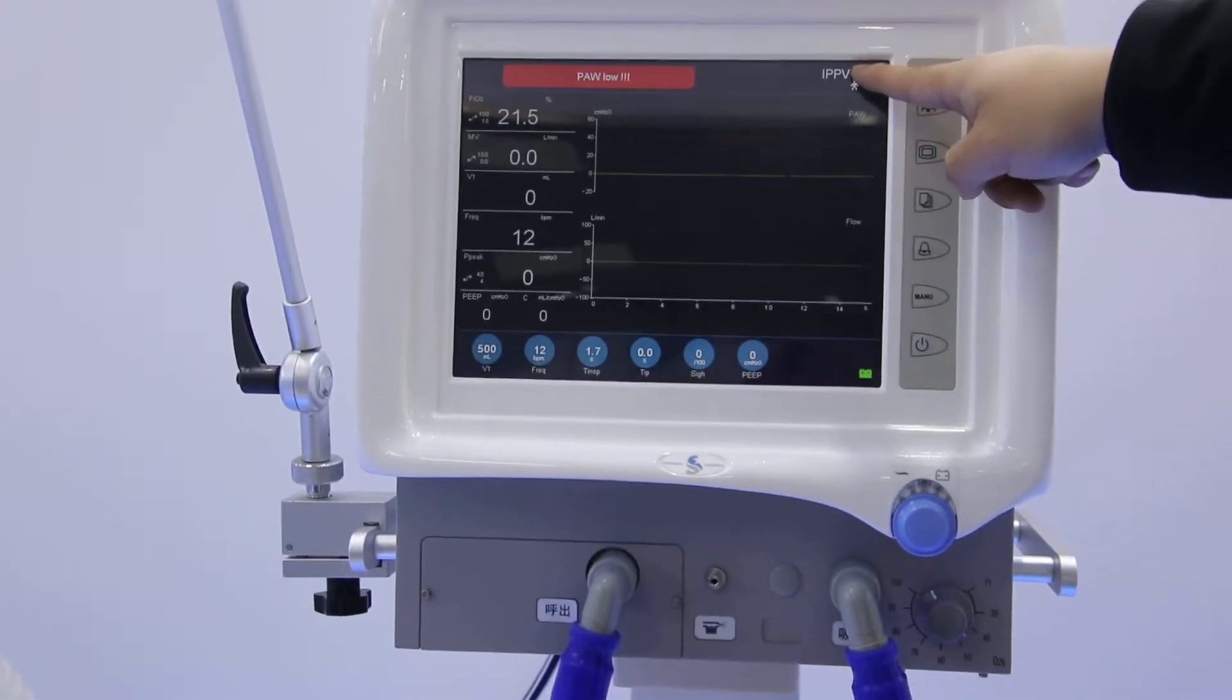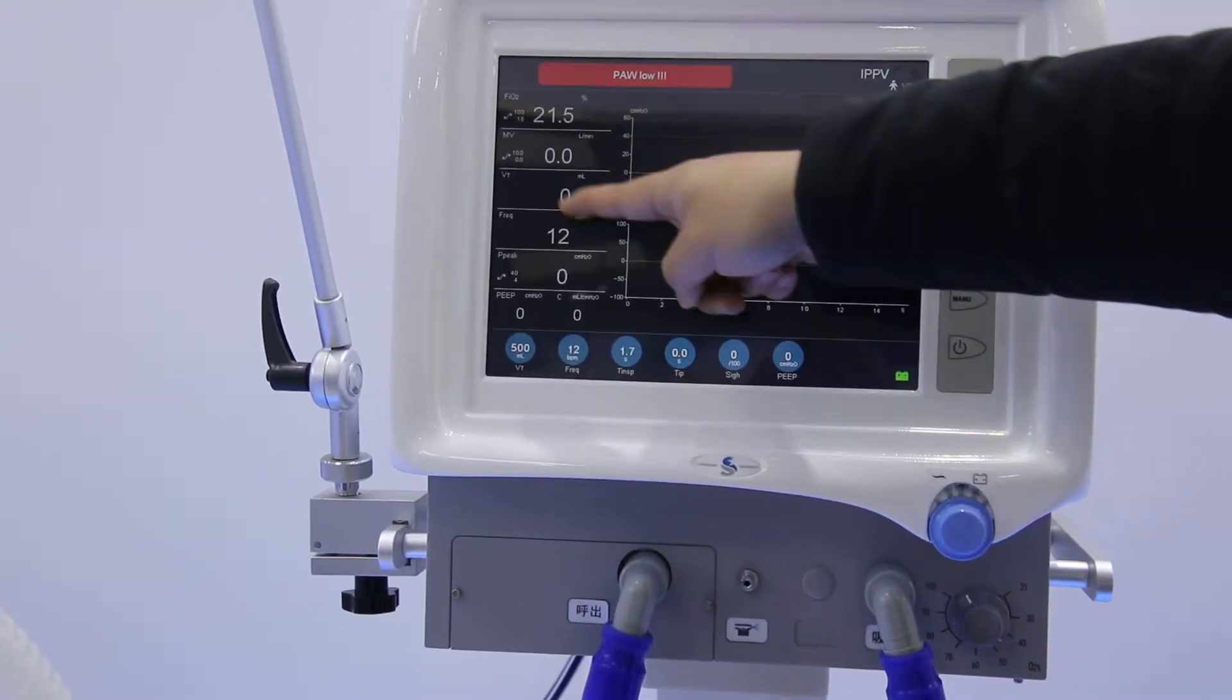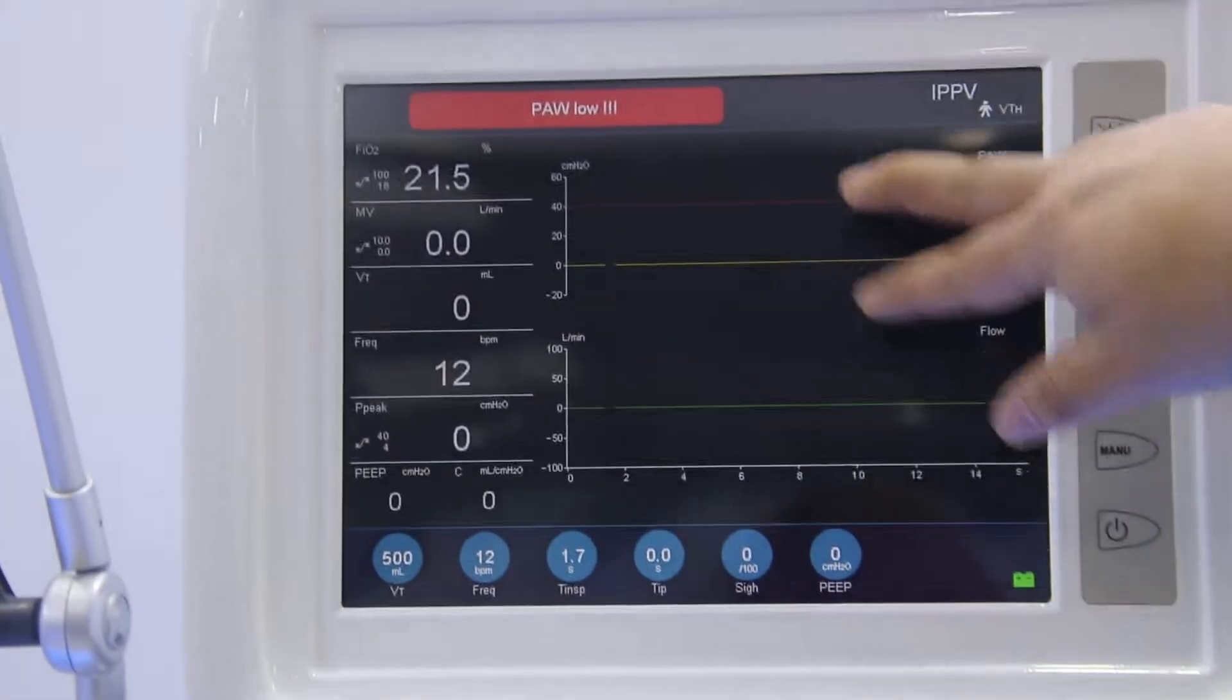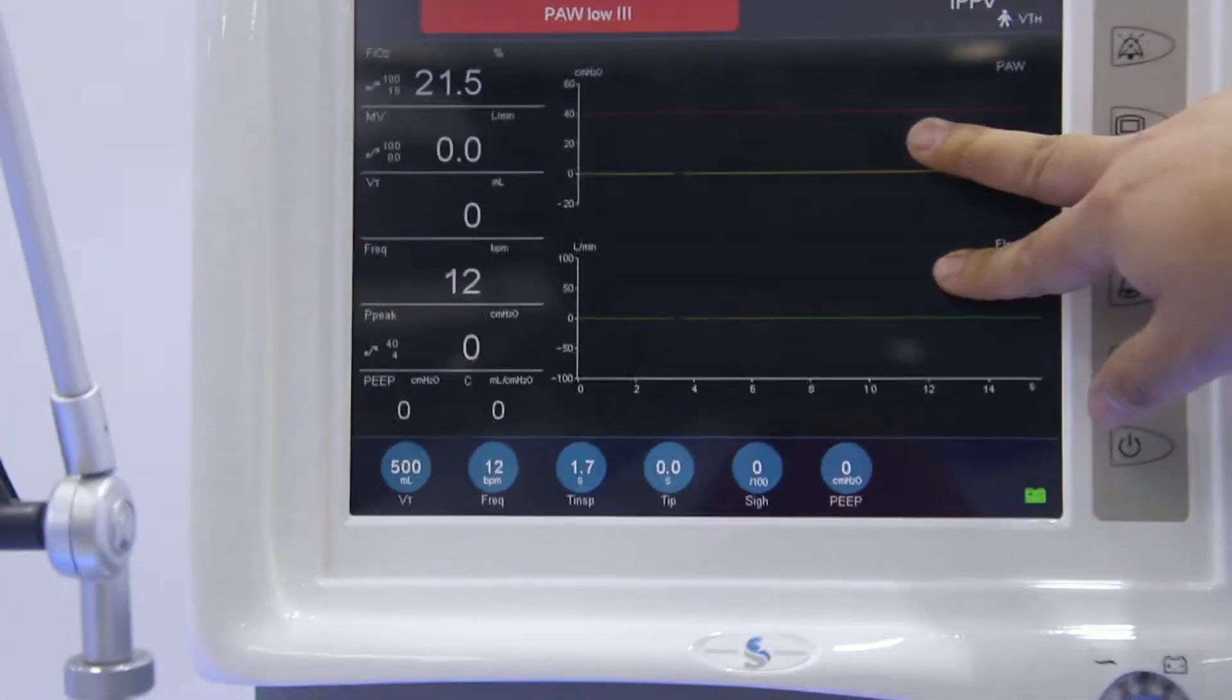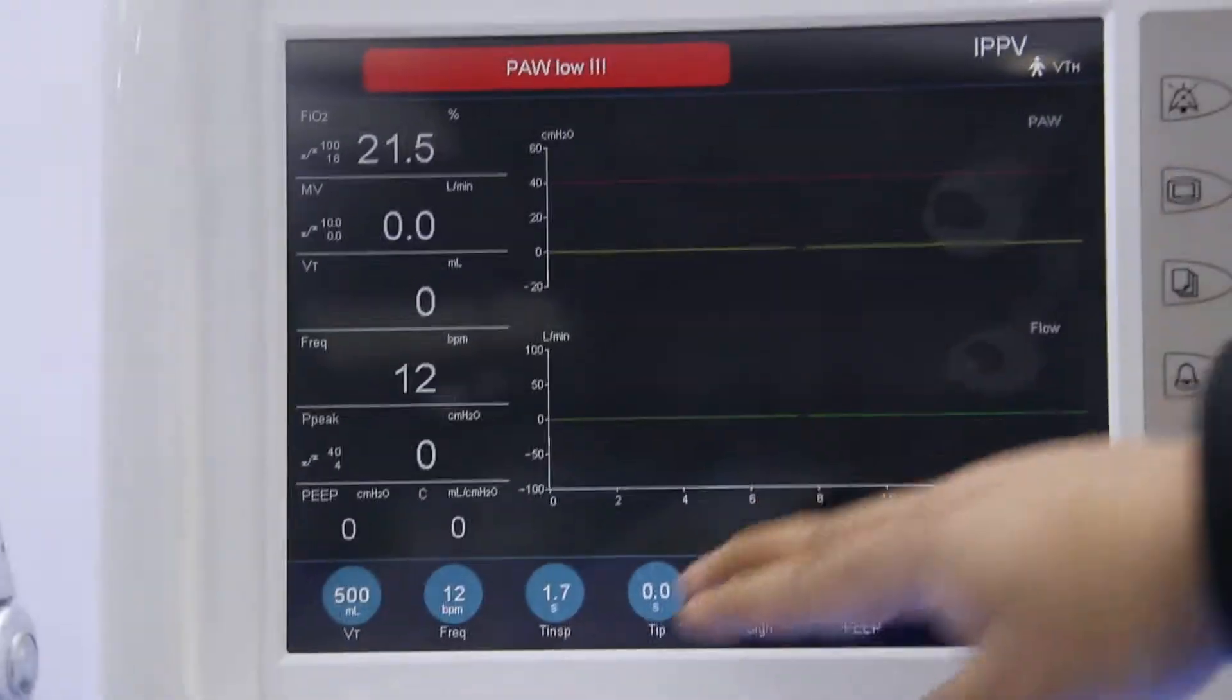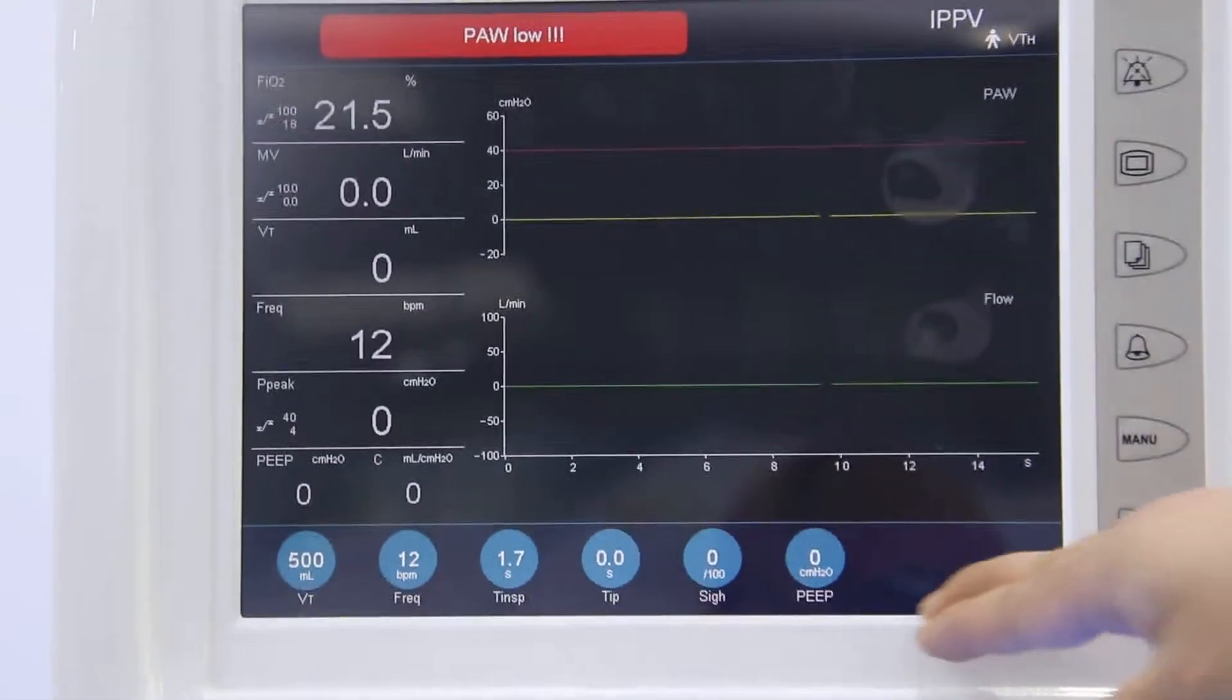And here is the ventilation mode we are choosing now. On the left side here is for the monitoring parameters. And the right side here, we have two waveforms for synchronous display shown on the screen. And each one of them you can choose for the loop. On the below side here is the adjusting area.